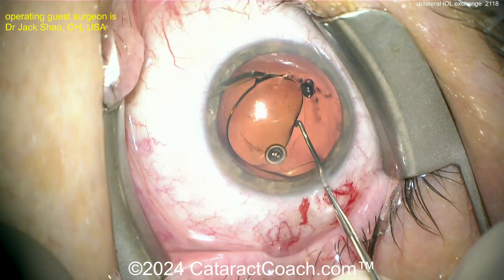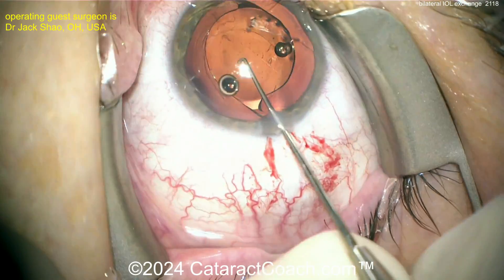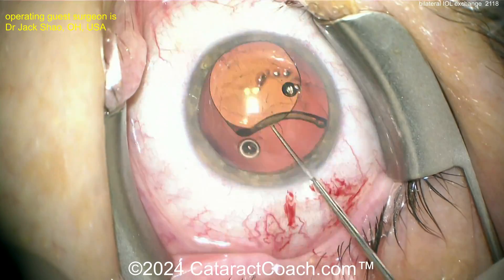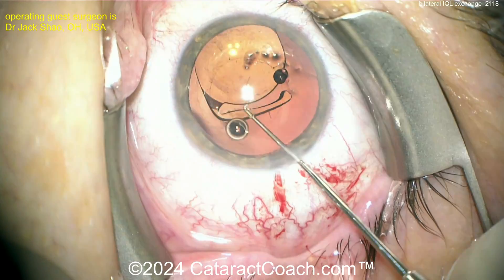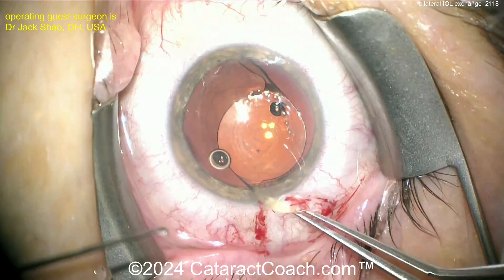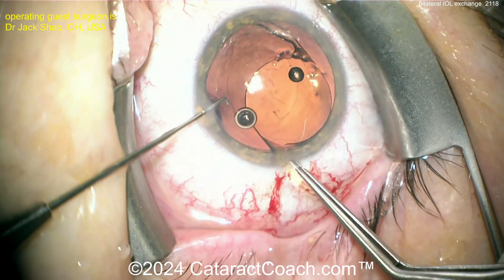If the patient were a year post-op, it would be a lot harder to dissect out this lens. There's the trailing haptic — the bulbous tip is where it gets stuck. In this case there really wasn't a whole lot of fibrosis, so that's really good. These come out pretty easily here.